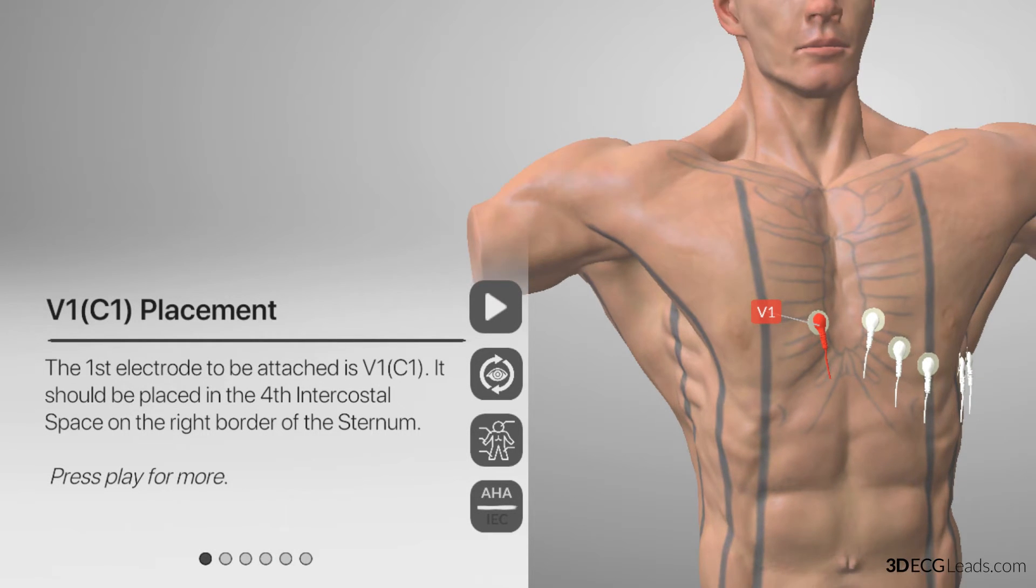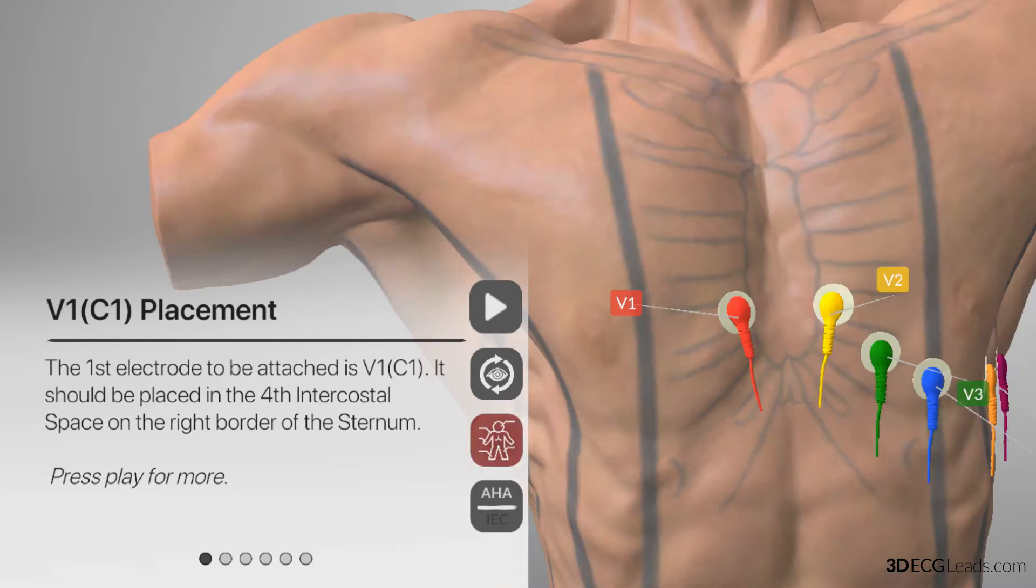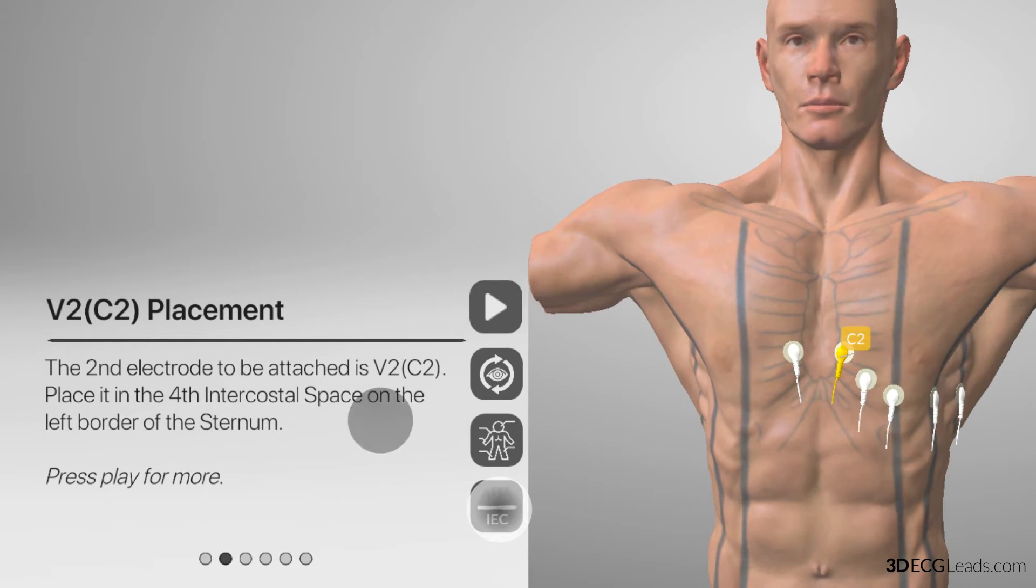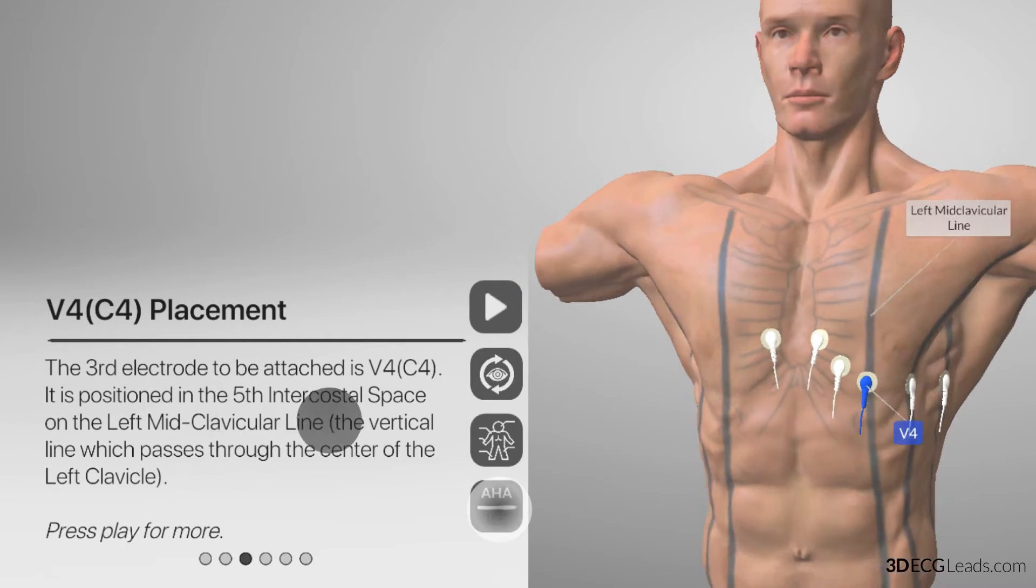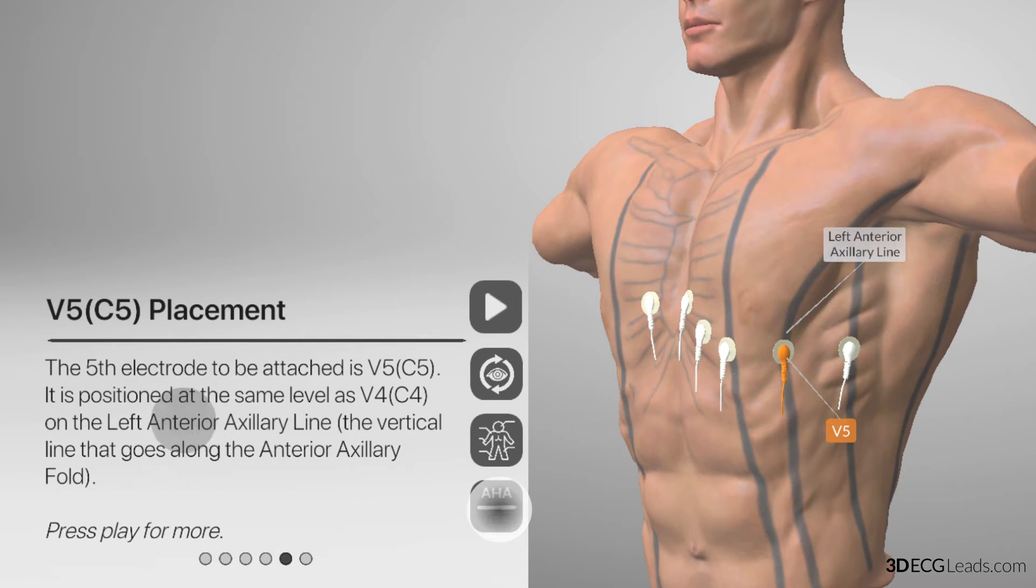As we switch between the systems, you can see the same lead has the same number. They are called V1, C1, V2, C2, V3, C3, V4, C4, V5, C5, V6, C6.